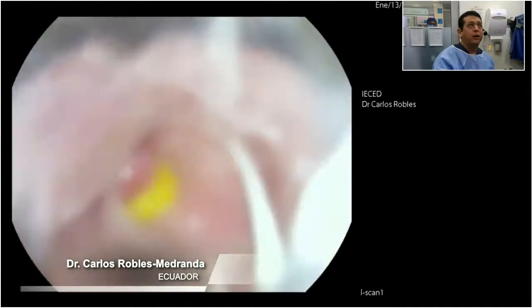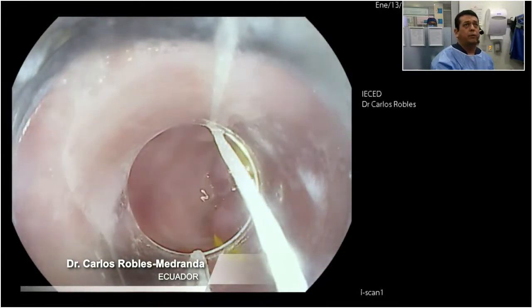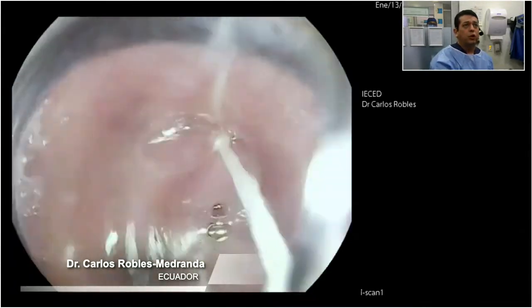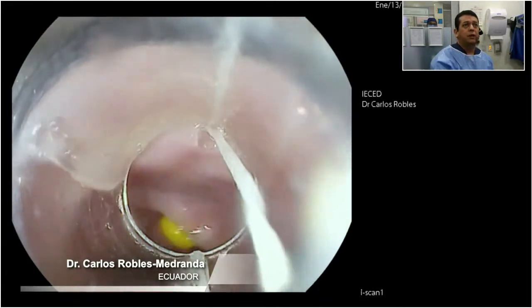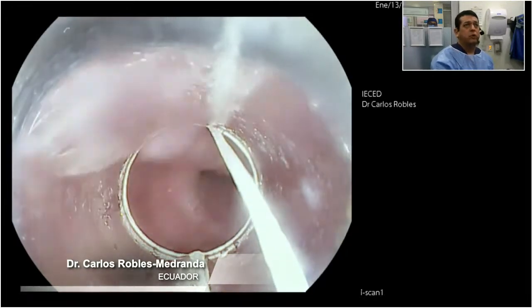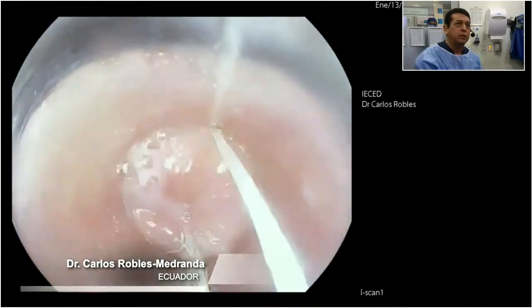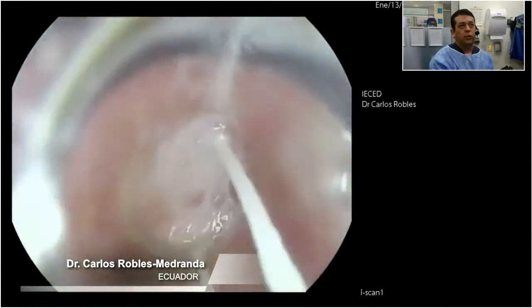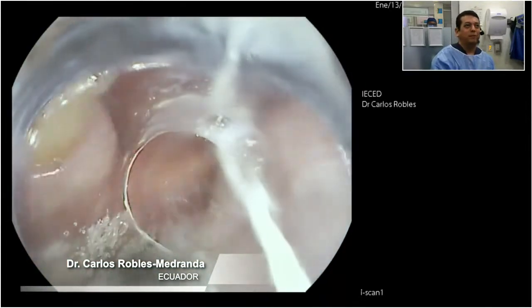So now I start to see the black rubber band, and this is very important because at this moment, you know that you have just two more shots. So I believe more ligation is not necessary. So I am happy with the treatment. Let's see in 8 weeks or 6 weeks how this patient is going. So thank you so much for assisting us. So Chris, my friend, the band ligator kit is good. Okay. So thank you so much.